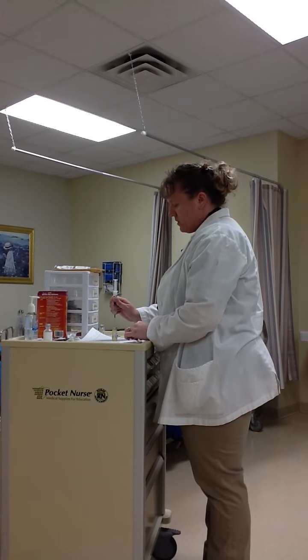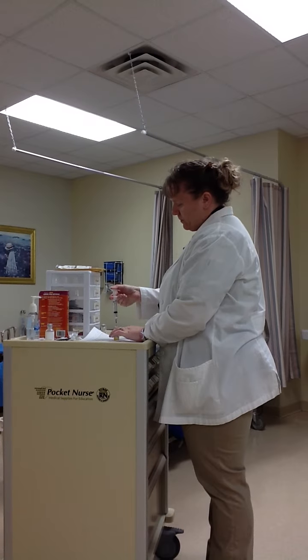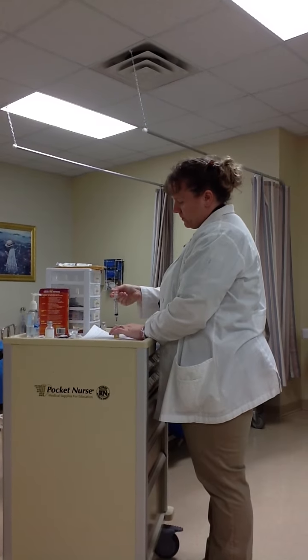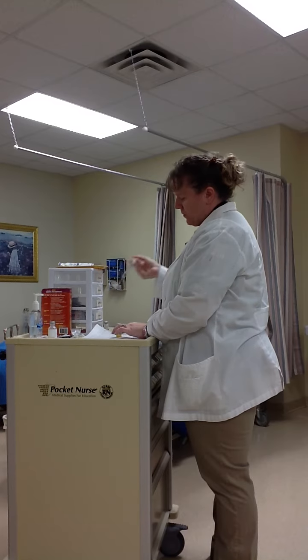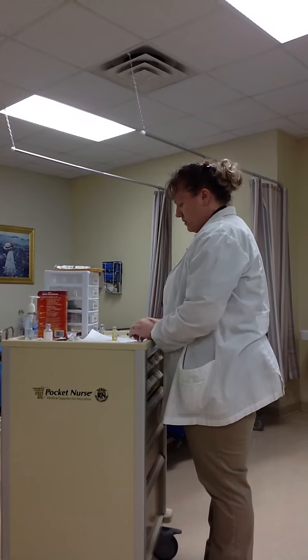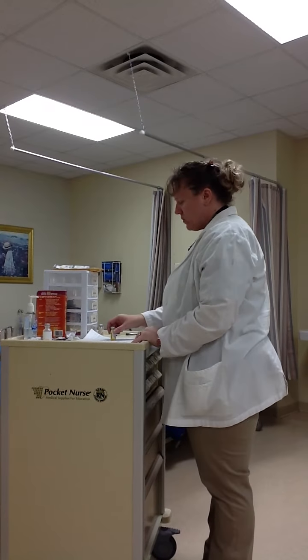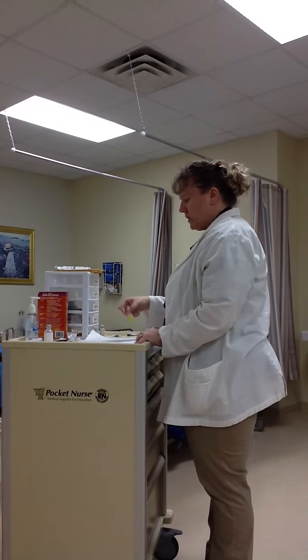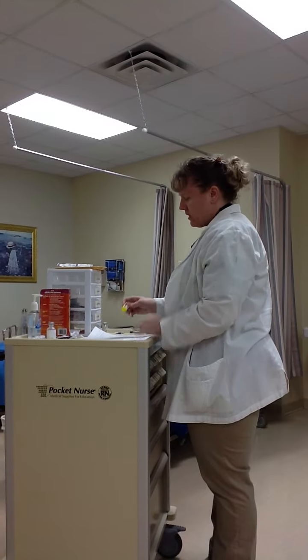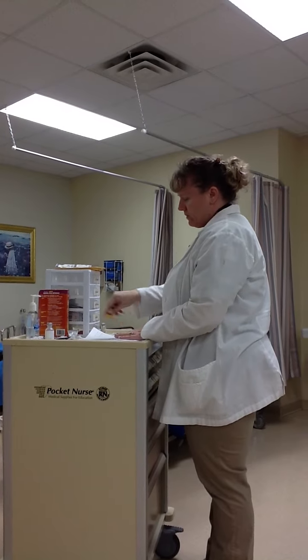I'm going to insert it into the diluent, push that 5.6 in, pull it out, discard this into the sharps container because I will no longer need it, and I'm going to reconstitute my solution by gently rolling it in my hands or swishing it around.